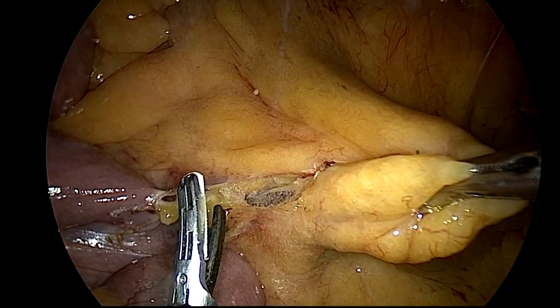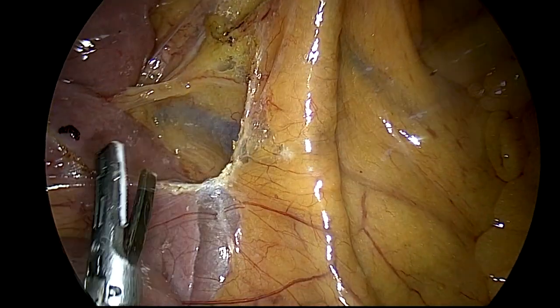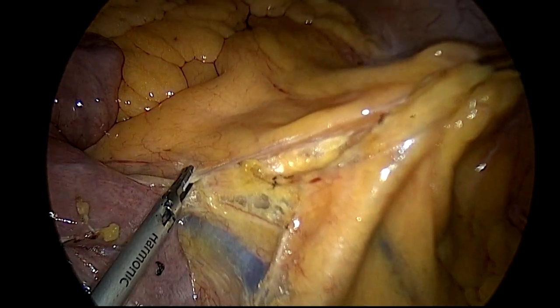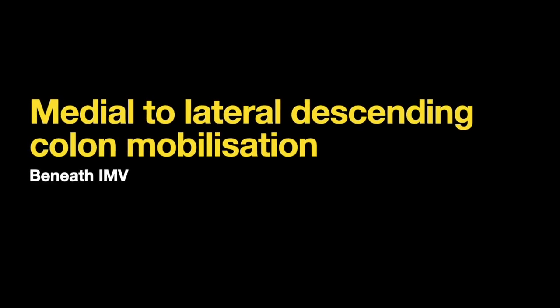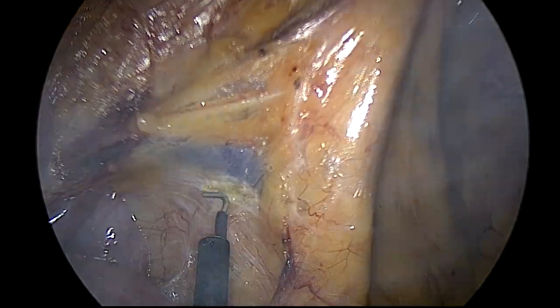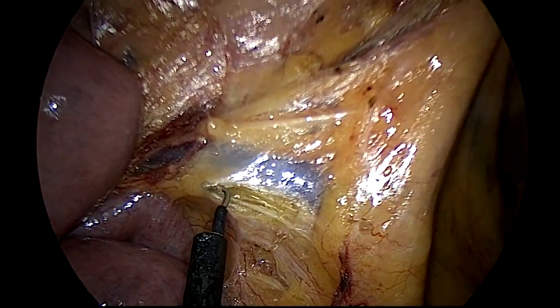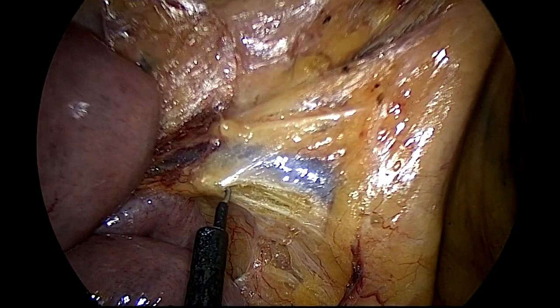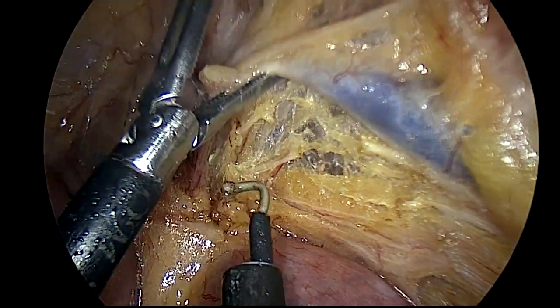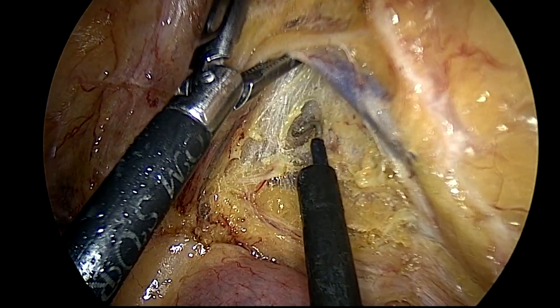In this case the IMV could not be identified clearly, and this is a key landmark without which medial to lateral dissection or splenic flexure mobilization is not possible. Hence we have to mobilize the mesocolon of the DJ flexure to expose it. Once it was identified we could go ahead with the medial to lateral descending colon mobilization and subsequently splenic flexure mobilization as well. A peritoneal incision is made beneath the IMV and a plane is developed above the Gerota's fascia in the avascular plane.